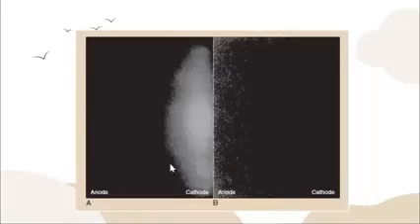Sometimes it can interfere with image diagnosis. With this irregular pattern, a pre-processing manipulation known as flat fielding, spelled F-L-A-T, F-I-E-L-D-I-N-G, flat fielding, one word, is performed, resulting in a uniform response to a uniform X-ray beam.